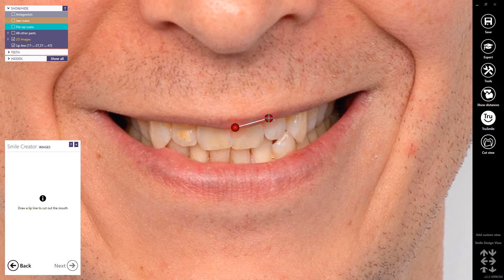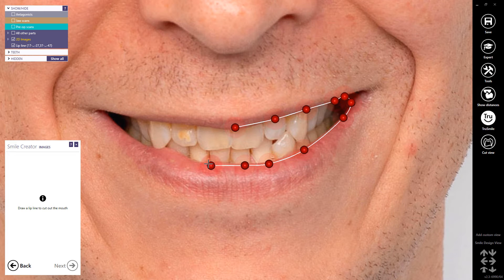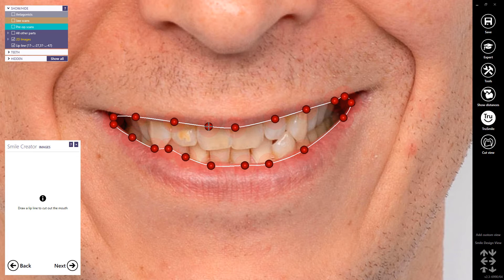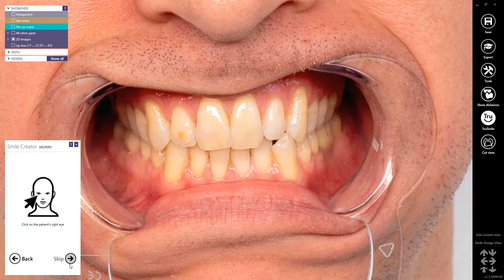Draw a lip line to cut out the mouth. You can add points by left-clicking the mouse, using as many points as you require to fully capture all of the lip line. To close the line, double-click, and you can move the points by drag and drop. To remove a point, hold down the left mouse button and right-click on the point. Proceed to Next.